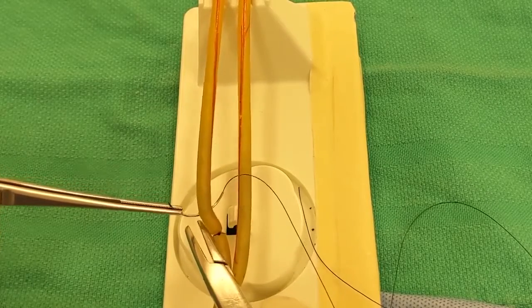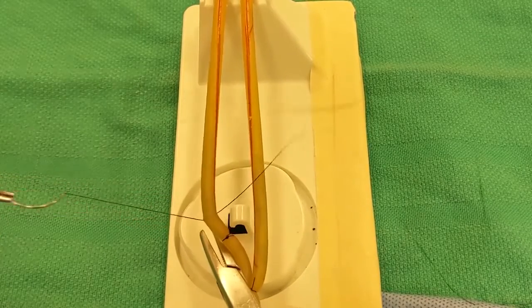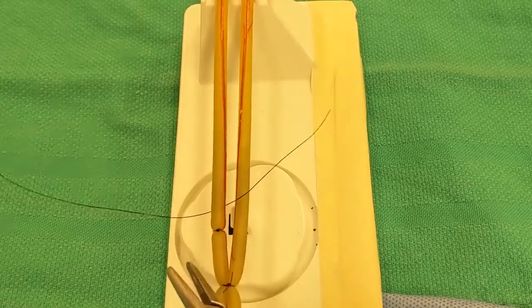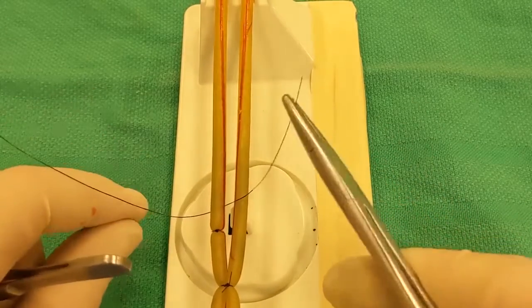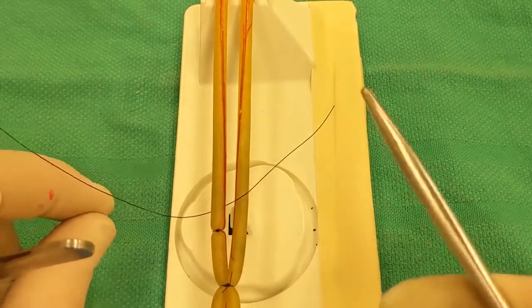And also, because it takes a bite of tissue there, it can't slip off of this vessel. It's going to be locked in place. You need to make sure your tag's long enough that this will be able to wrap around your pedicle after your first knot.